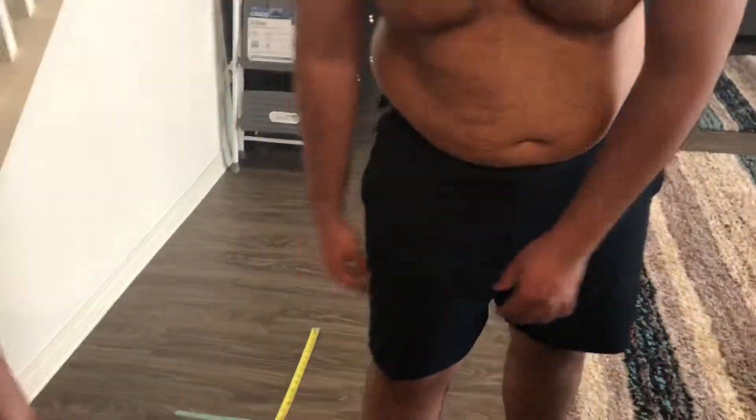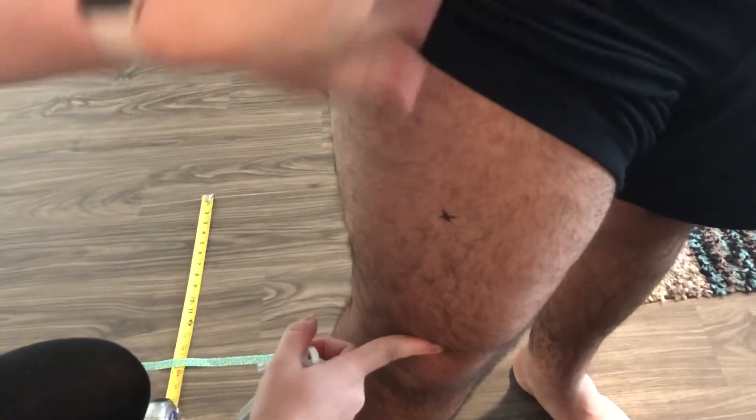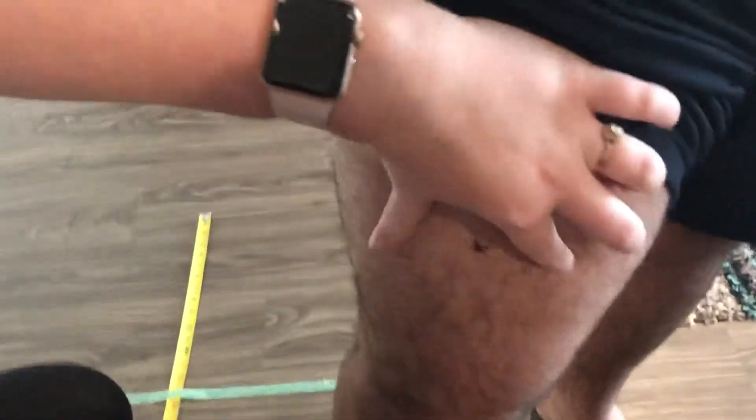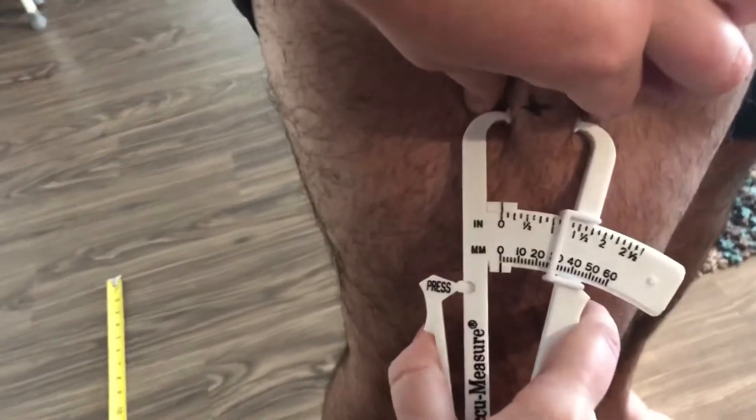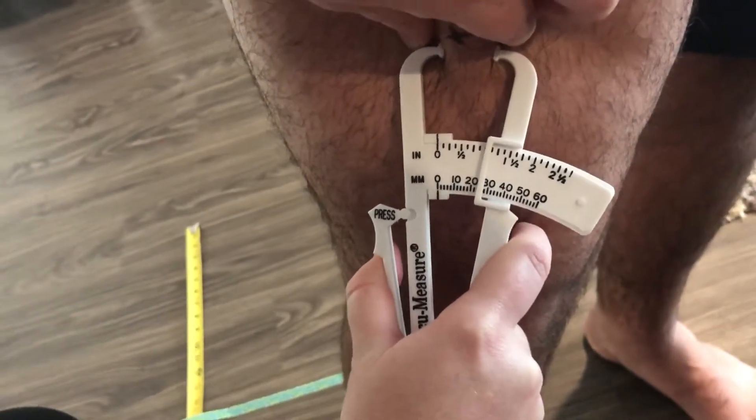Now I'm gonna go ahead and do the thigh. You want to measure right here where the hip bone is to about the knee, so right around the pelvis area — about halfway in between there, and that's where that mark is. Another three-inch pinch and pull, and we're gonna get about one inch on that measurement.